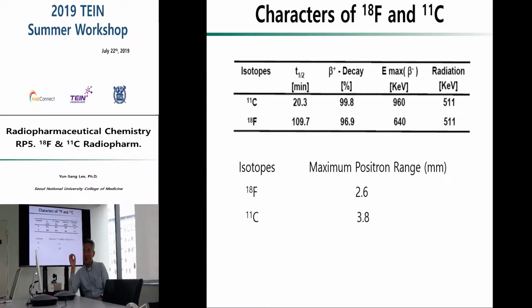For every brain receptor imaging agent, it depends on the number of receptors. I mean, after 2 half-lives, 3 half-lives, 4 half-lives, we can still acquire images.